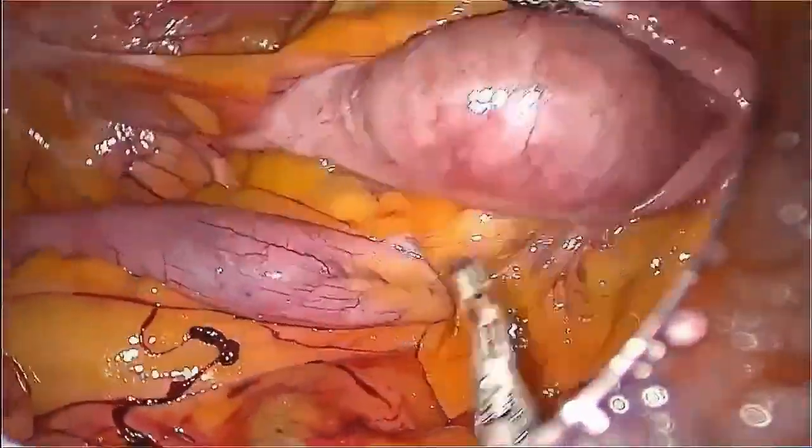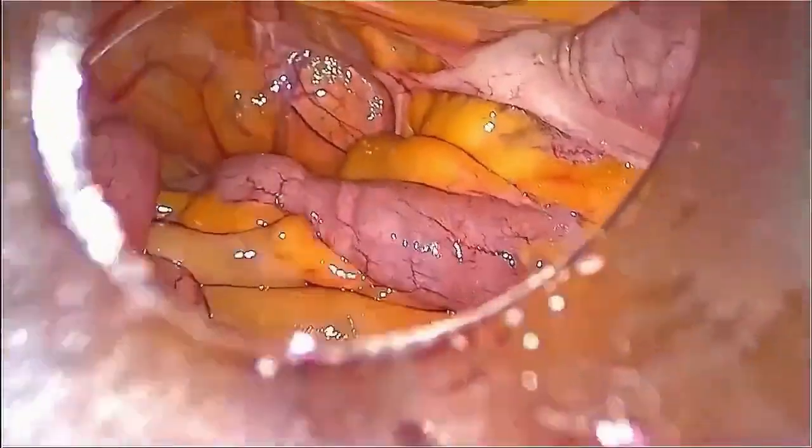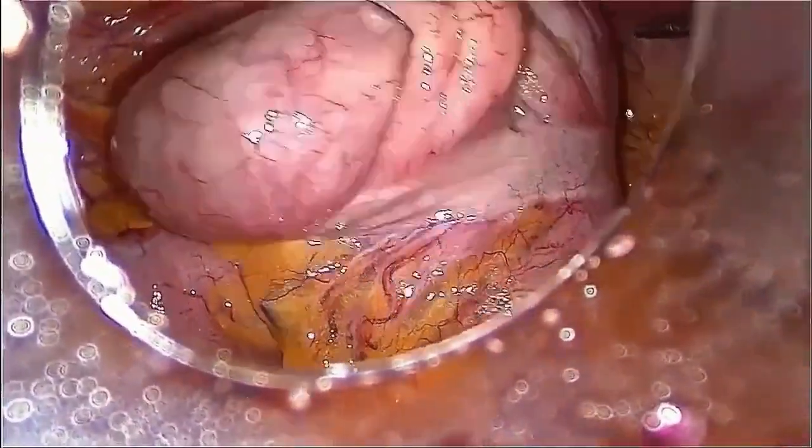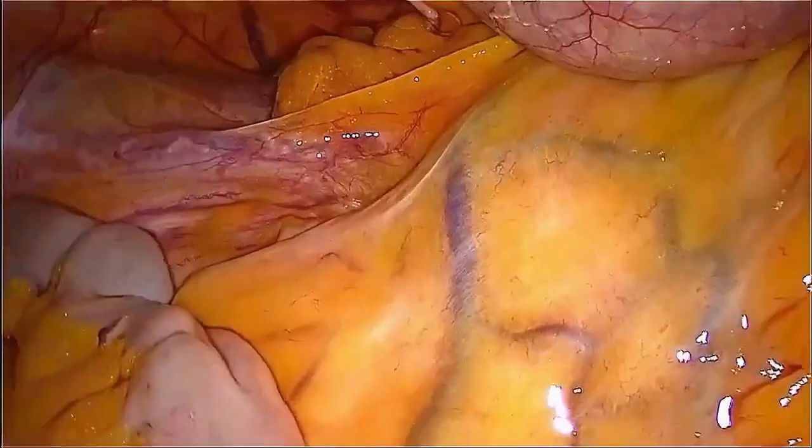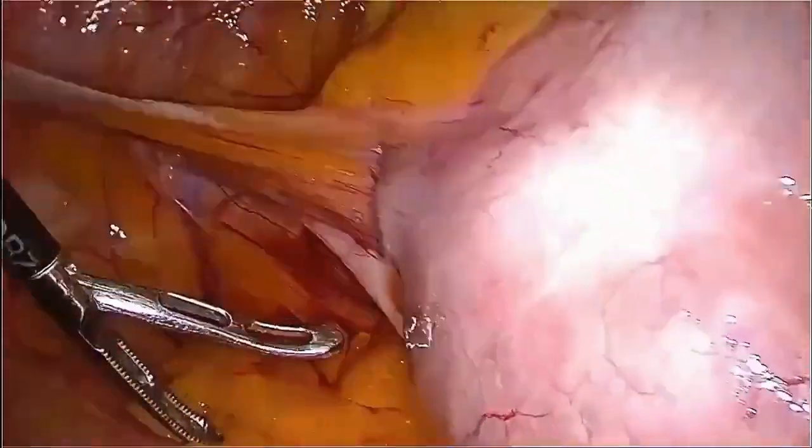For the best exposure of the peritoneum below the ileocecal region, it is necessary to change the operating table to the Trendelenburg position and to reposition the transverse colon over the liver.